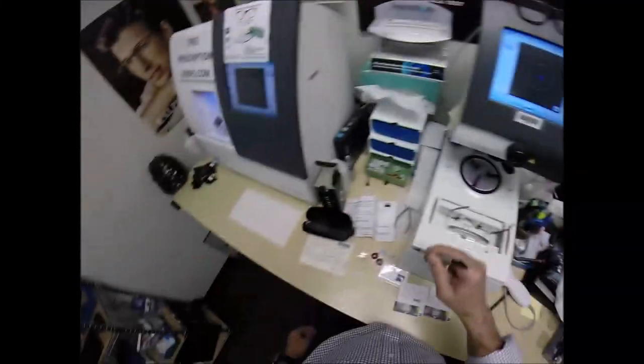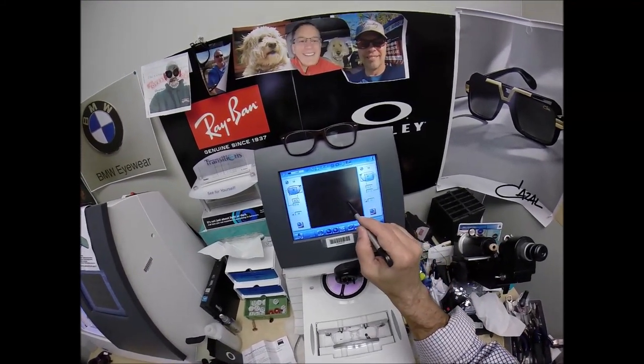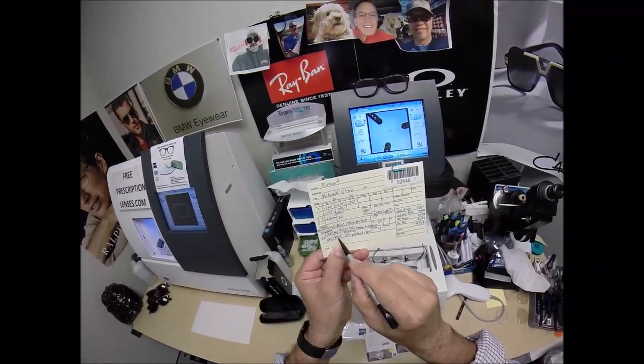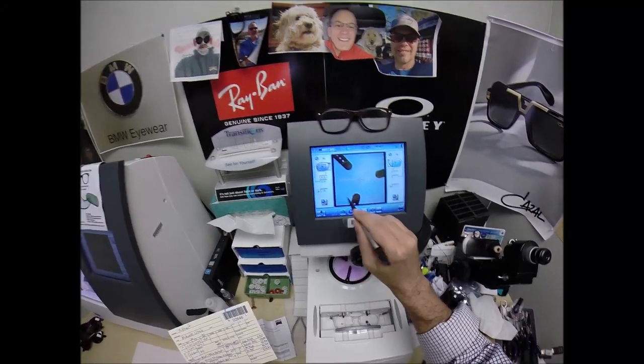So that's what Robert did. Hit the next button. That's the shape of the lens. If it pops up that I'll be cutting, I need to enter your pupillary distance, which is 33.5 for each eye. The computer starts at 32.5, so I tap the plus button twice.